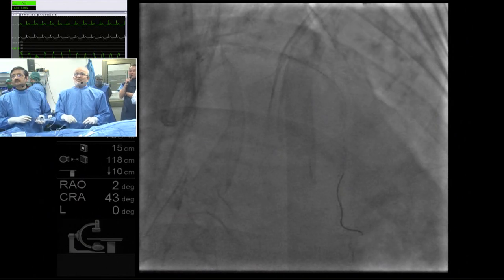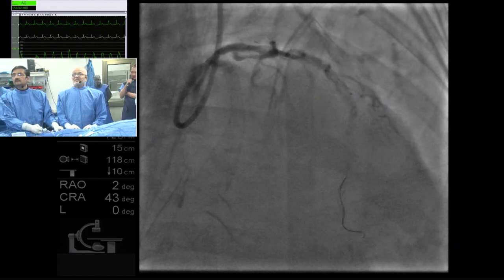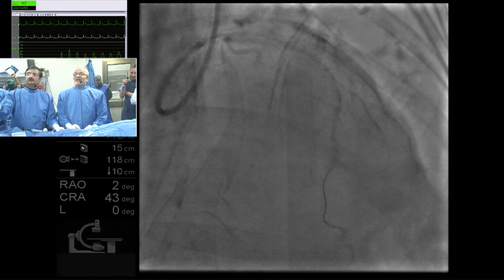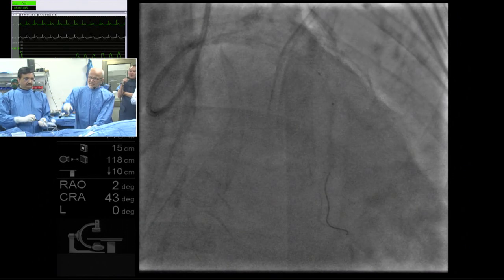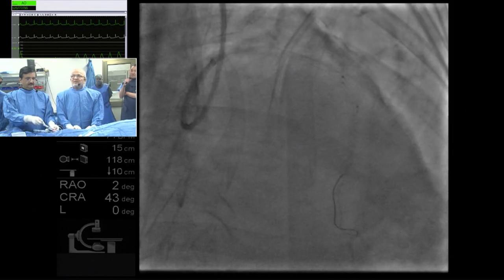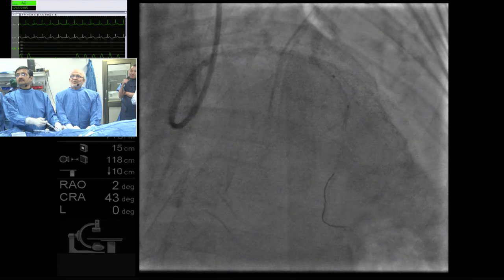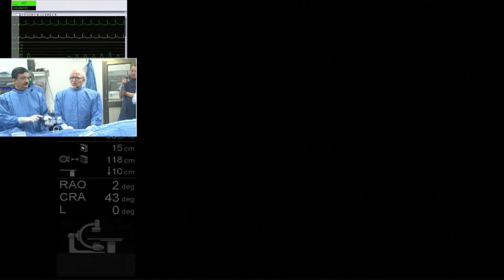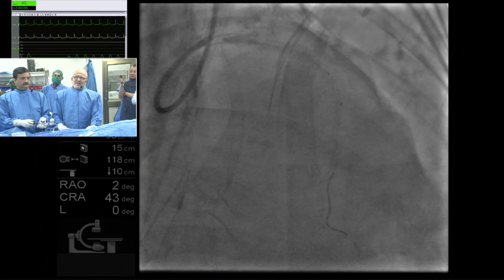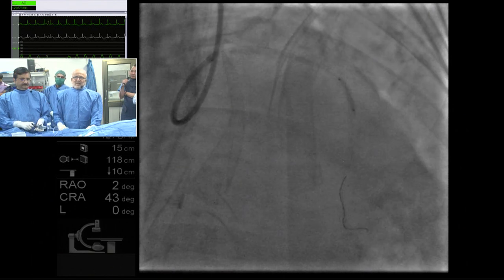Working so much with this type of arteries, I have realized that I have to remove it at times and again do the same thing. That's why. Let us see. So instead of IVL, a scoring or a cutting balloon, do you think that would be a trick? The literature up to an extent says that IVL gives, in some of the cases, the best MSA.